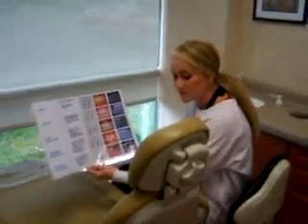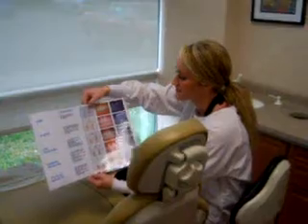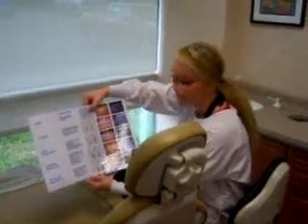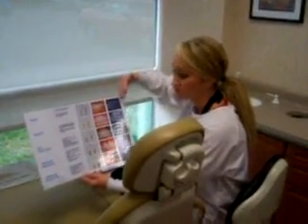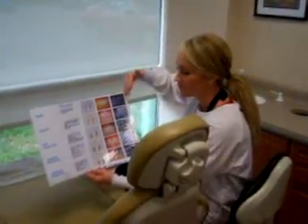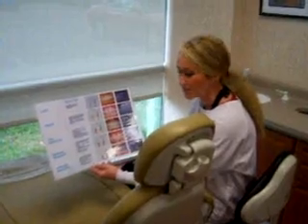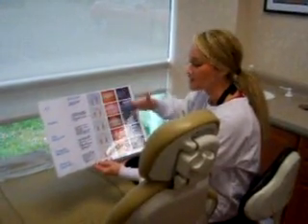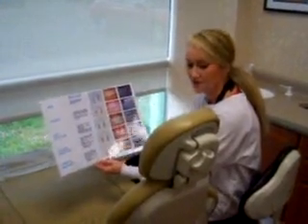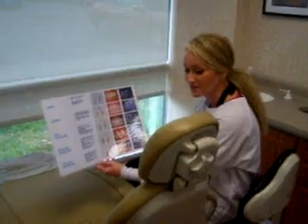So what I'm going to be doing today is measuring six places around the tooth. We want to hear numbers between one to three. If we get anything over three, we'll pull this chart back out and decide what classification you're in. Do you have any questions for me?